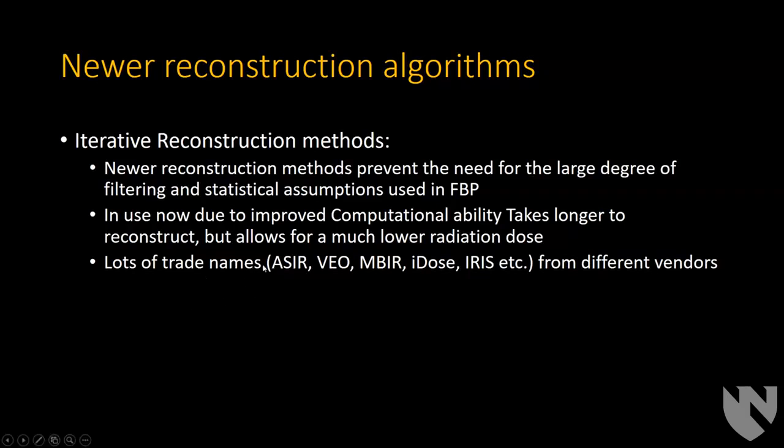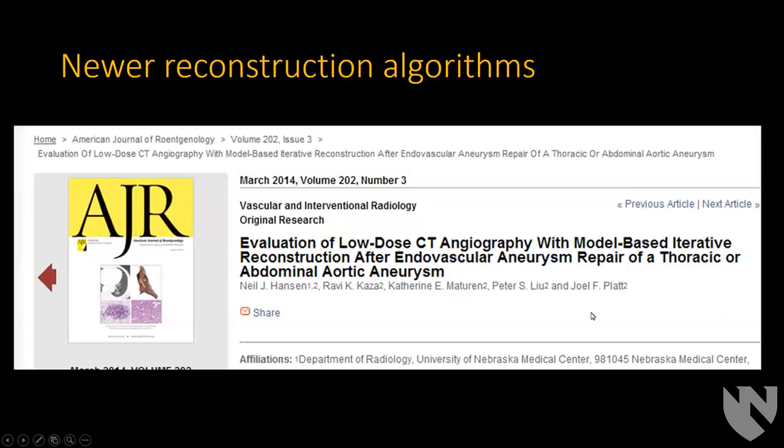So of course there are lots of names for iterative reconstruction, like ASIR or Veo and iDose, things like that from different vendors. And of course Dr. Hansen did some research on iterative reconstruction.